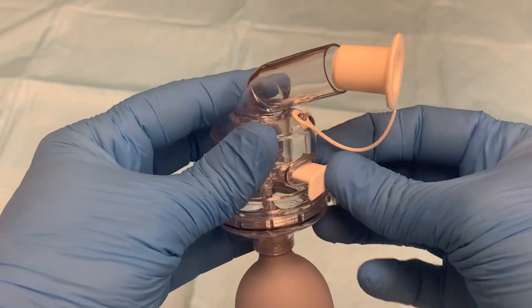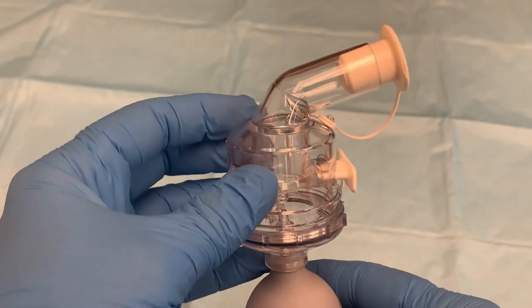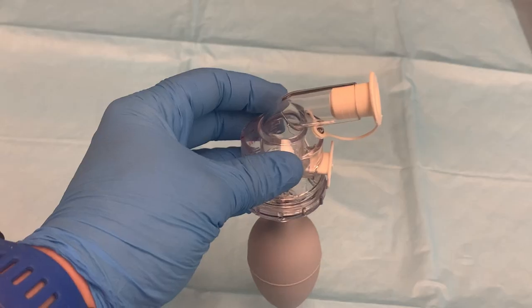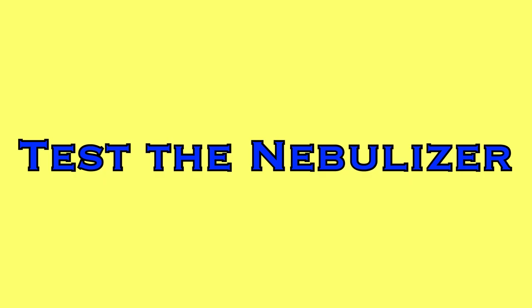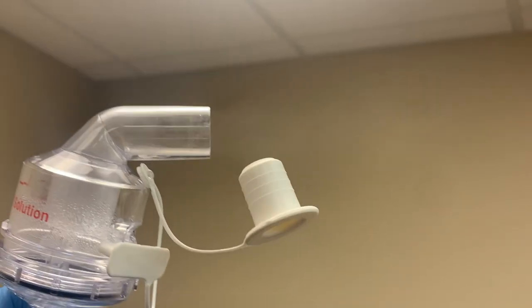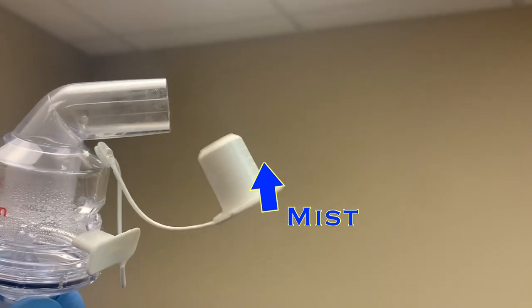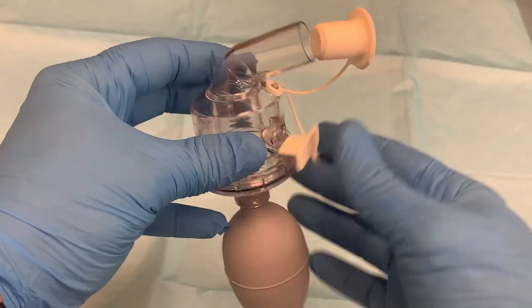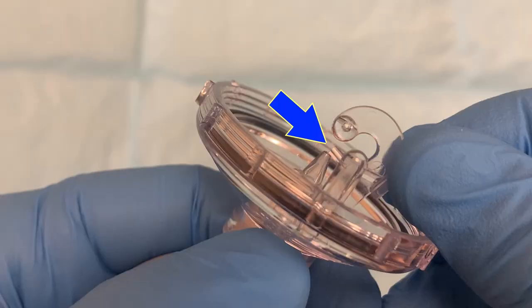If you won't be using the nebulizer right away, you can plug the two openings on the lid with the attached plugs. When you are ready to use the nebulizer, remove the plugs so the nebulizer is open to air in both places. Test that the nebulizer is working by visualizing an aerosolized mist leaving the device. Hold it up in front of a light source and squeeze the bulb. You should see mist leaving the spout on the top. If you don't, check to make sure both plugs are open and that the question mark shaped insert is fully pressed onto the nebulizer tip.